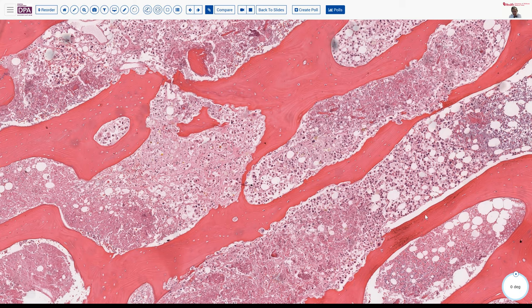I've seen a lot of immunohistochemistry performed in the developing world where the validation of the reactivity of the antibody with the specific processing method that has been used has not been carried out with any degree of rigor. And so it's very common in that circumstance to have false negative reactions. And that really doesn't help you or the patient. So I encourage you to properly validate your immunohistochemistries to make sure that you can predict the reactivity reliably based on enough samples.